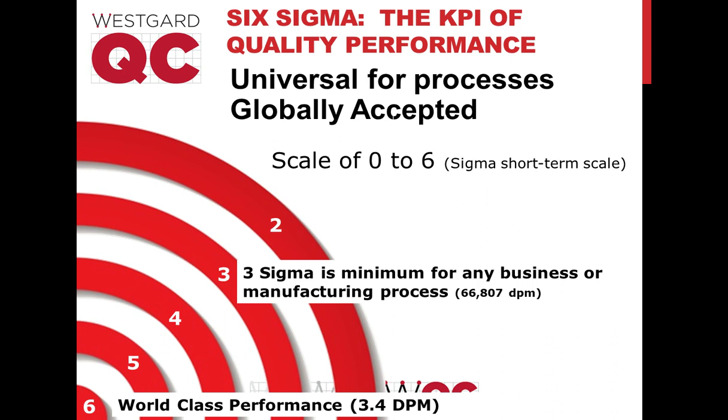I do want to calm everyone. Just because you're looking at a Sigma metric every month doesn't mean that any change will cause you to change how you're doing QC or how often you're going to run QC. We have examples on the website where labs have been running instruments for 8-9 years and monitoring Six Sigma metrics for that entire period. And for some tests, they haven't changed their Sigma metric effectively for that whole period. That is, it was Six Sigma 9 years ago, it's Six Sigma today, it's been Six Sigma throughout those 9 years. It may have fluctuated slightly, but it stayed above Six Sigma, and that meant there were no QC modifications that had to be made for that entire period.